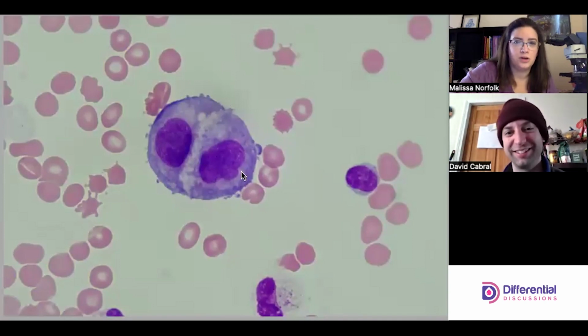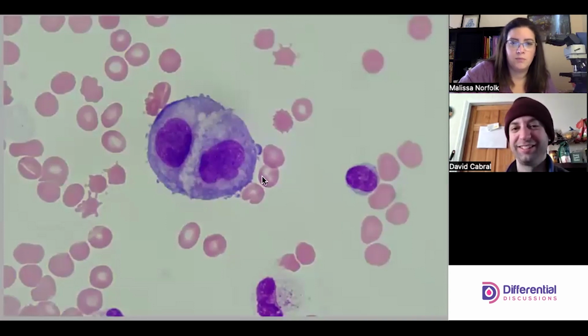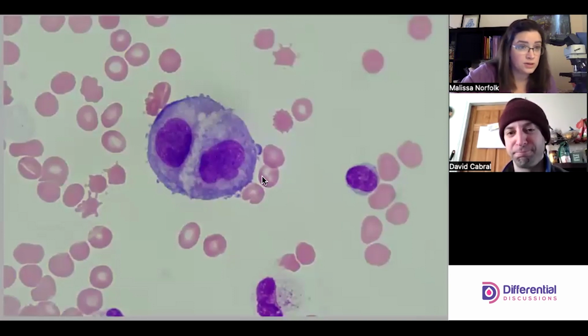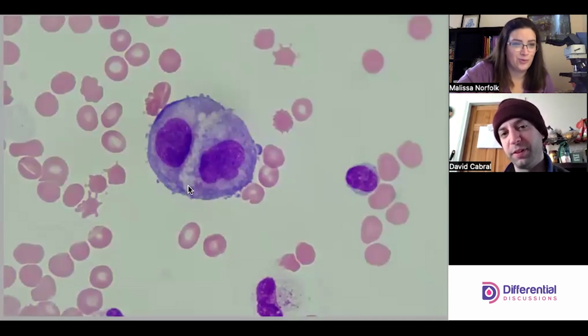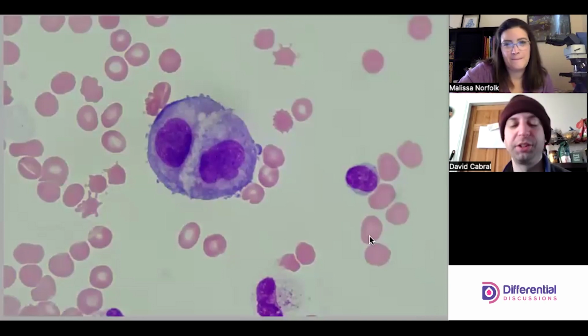And then the nuclear contours, the cytoplasm has a similar look, where it's darker at the edges and lighter in the center, which is what our other malignant cells have been doing. And the coloration of the nucleus is off. Again, it's hitting all of the things that malignant cells have, save the window. This has a window, but it's not a normal looking window. Yeah, especially in comparison.